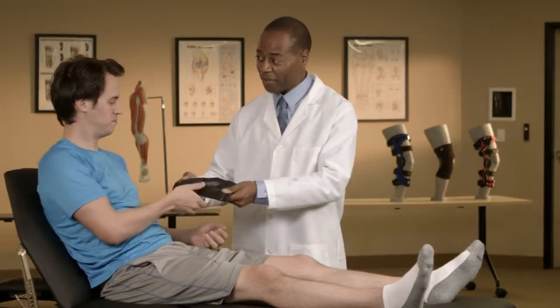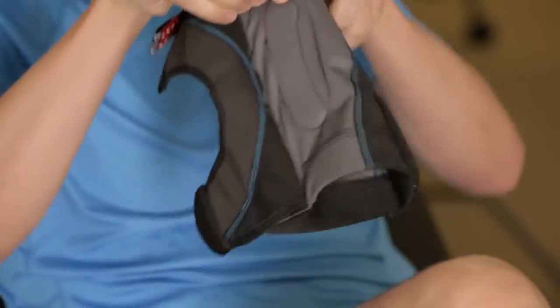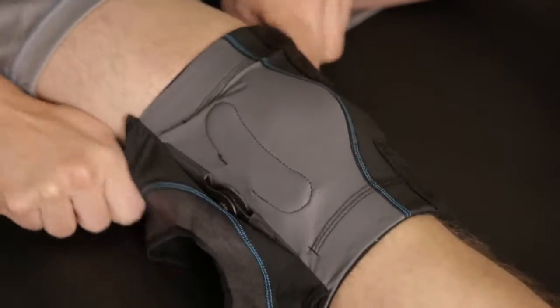Now let's apply the brace. It's best to start in a seated position. You'll first open the brace completely. Next, you'll step through the sleeve as you would a pant leg or sock, and fully extend your leg.